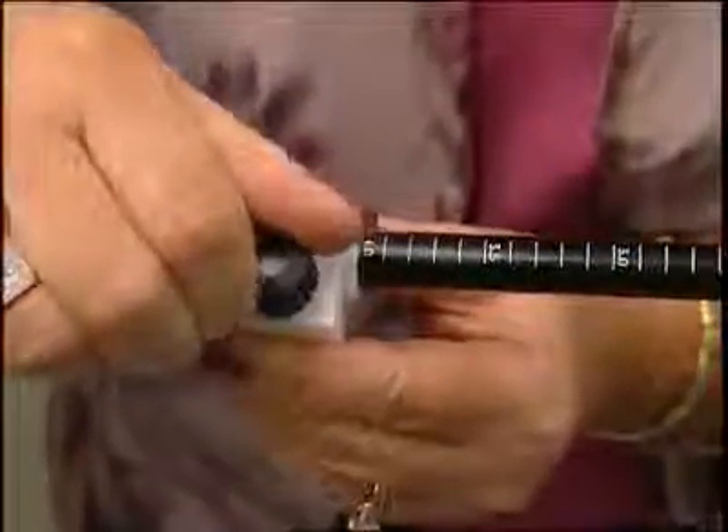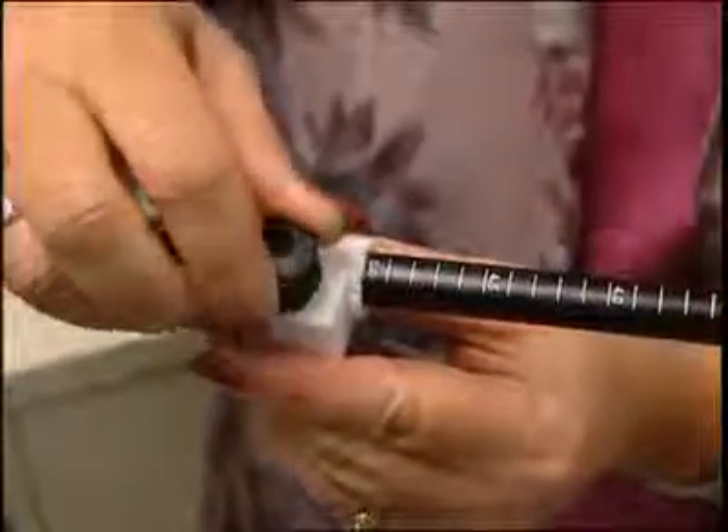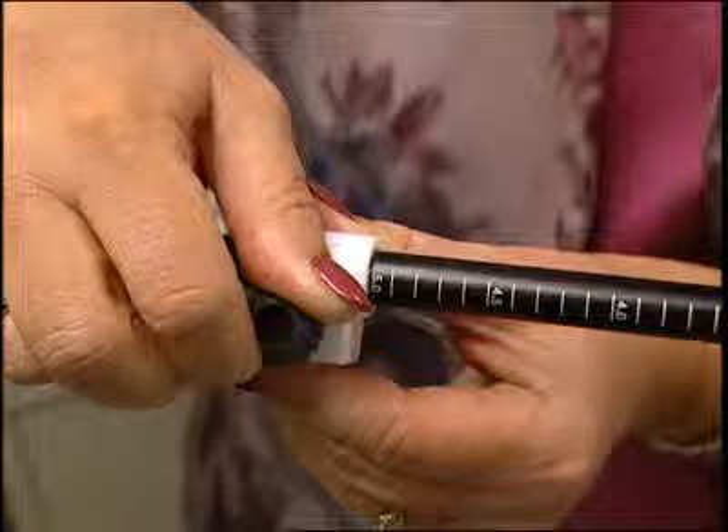Then change the locking collar to 5 liters and perform the final 5 tests of the middle range gas. At this point, you should have 15 tests completed, and more if any that you performed had a breath hold time outside the acceptable parameters.